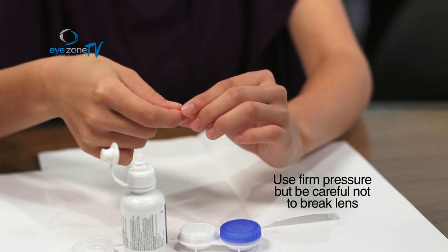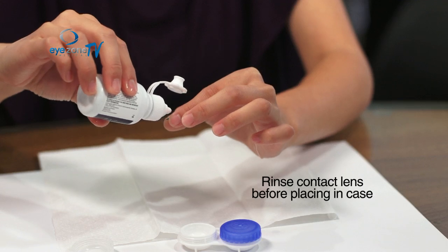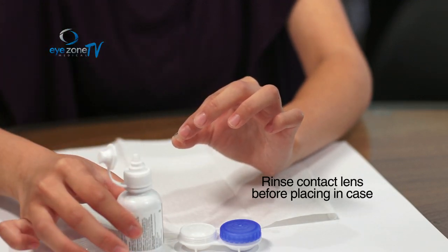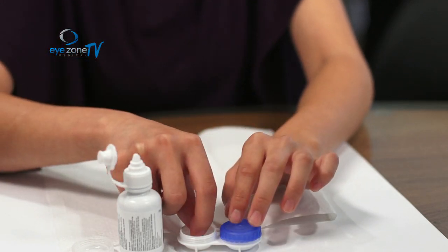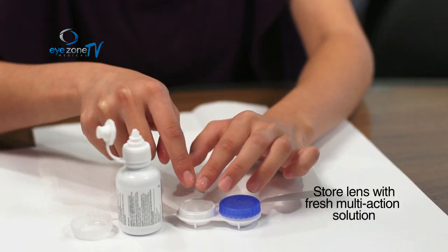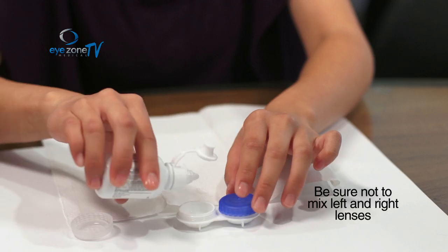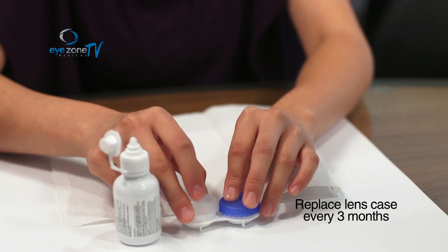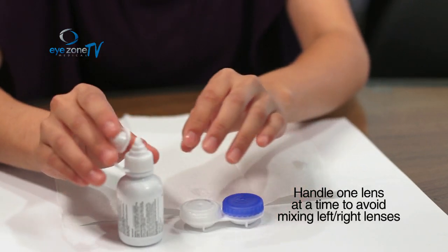After rubbing the lens for about 15 seconds, you need to rinse it — rinse with the same solution, not with tap water. Then store it in the case: put the lens in an empty case and fill it with fresh solution every time, enough to cover the contact lens, then close it up. This way you keep the left lens and the right lens separated.